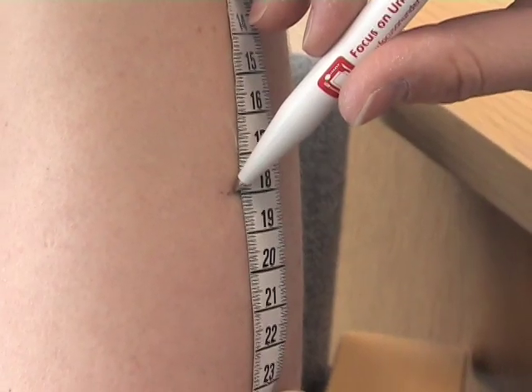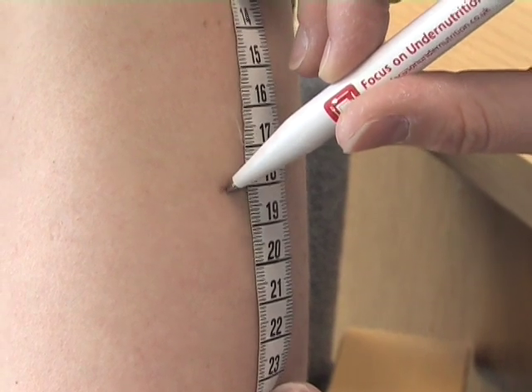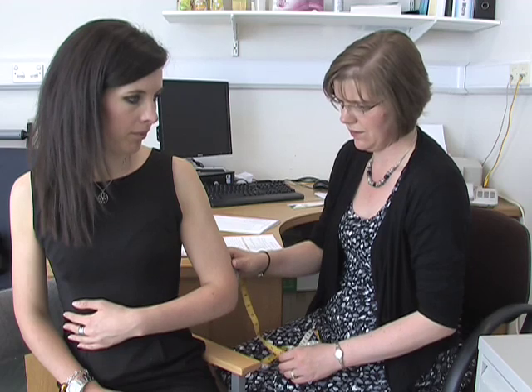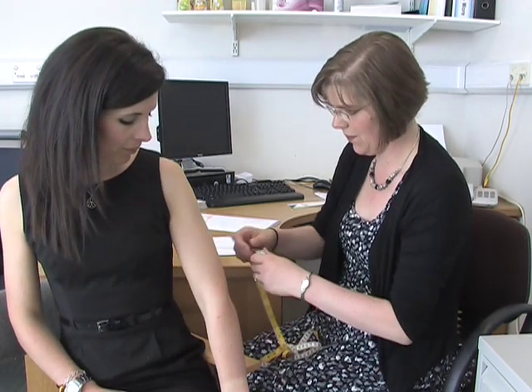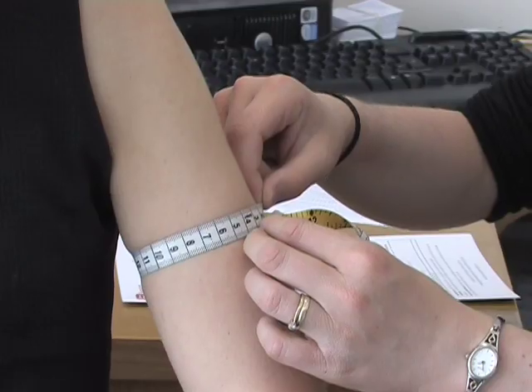Mark the midpoint. For instance, if this measurement is 36 centimetres, you would need to mark the point at 18 centimetres. Then ask the person to let their arm hang loose. Measure around the arm at the midpoint to the nearest millimetre, making sure that the tape measure is snug but not too tight.